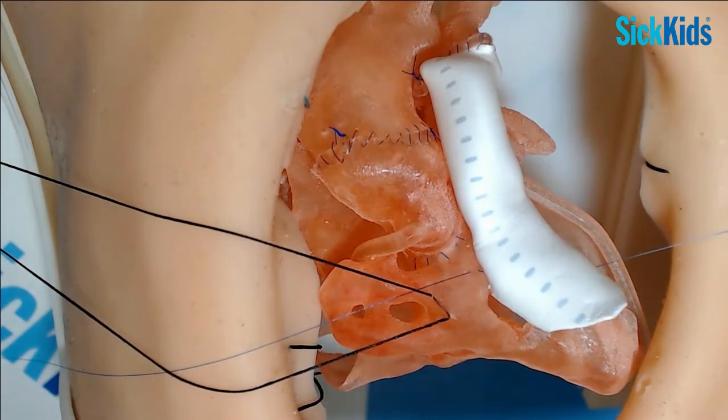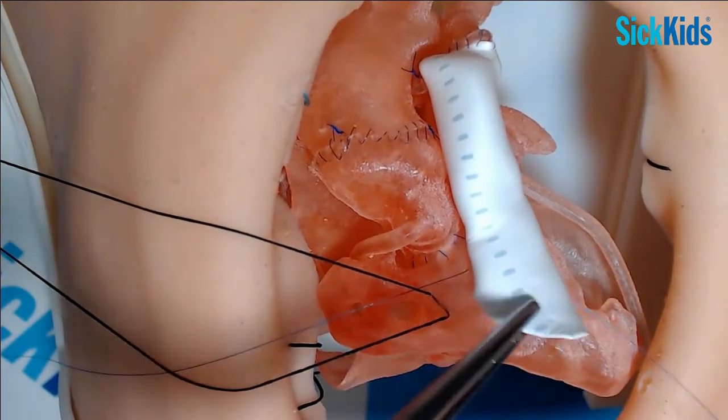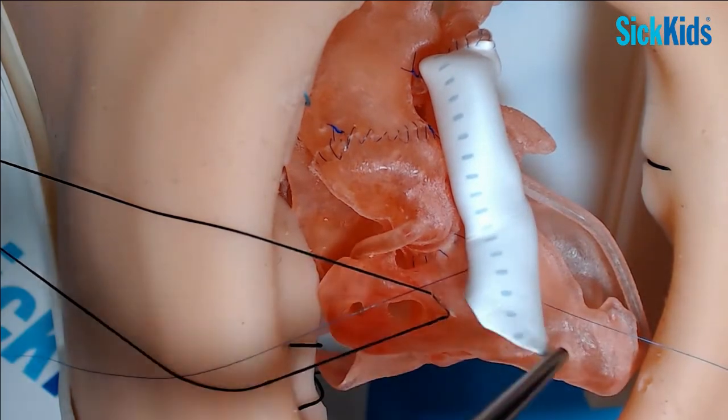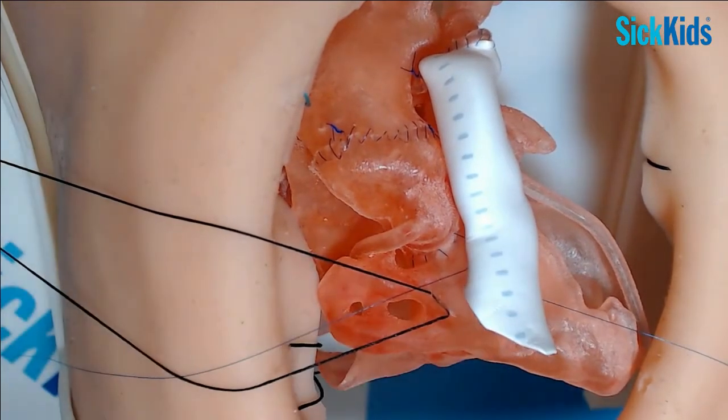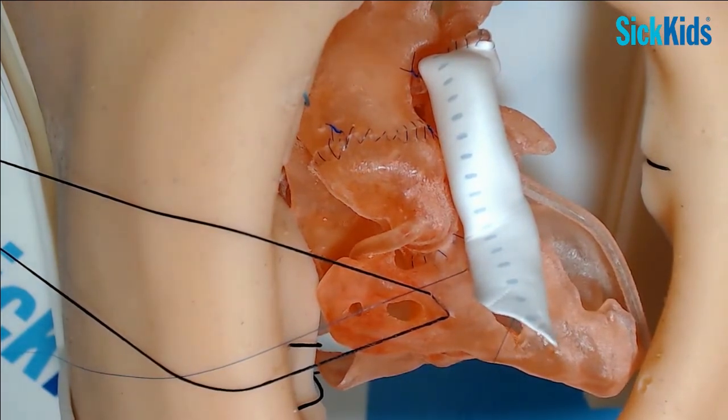Okay. And then what you should end up with is a longer free edge than there is edge of the patient. And so you're going to near and far it all the way around, so you make a sort of cobra head.